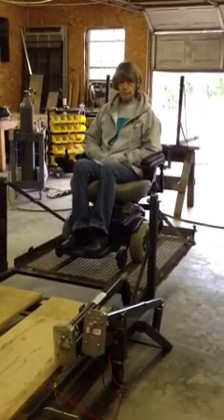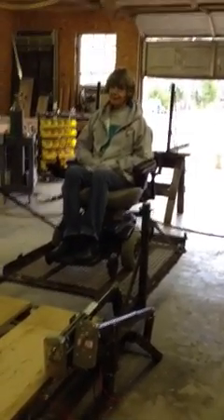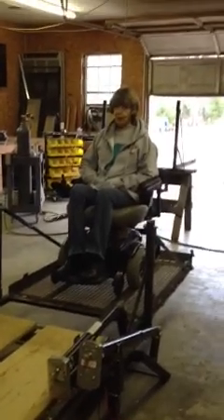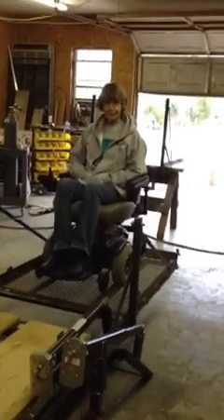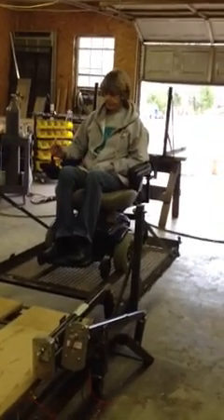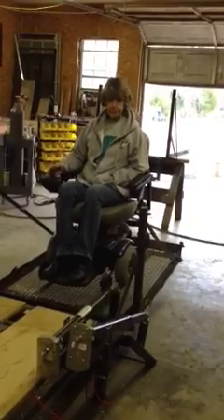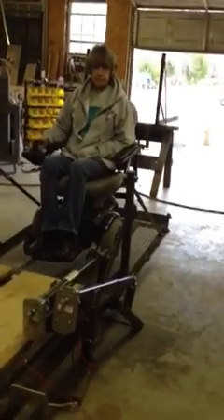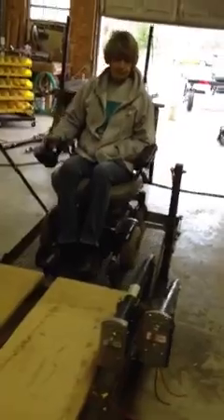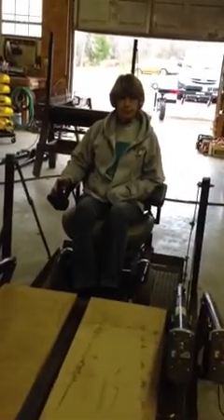She weighs about 100 pounds, and the wheelchair weighs probably about 150 pounds, so you're looking at about 350 pounds there. Let her down again. This thing is very slow, very smooth, and the weight is no problem — and that's what I'm fixing to show.